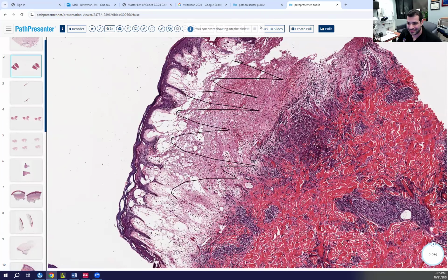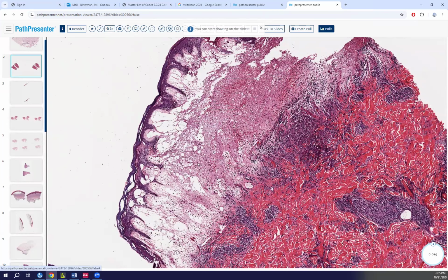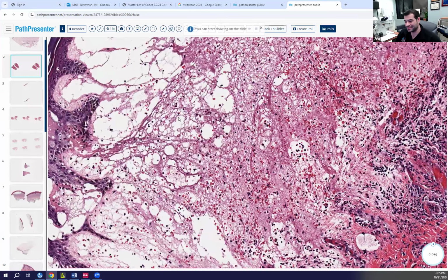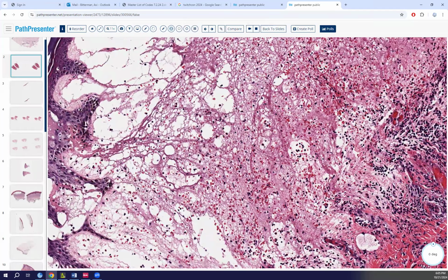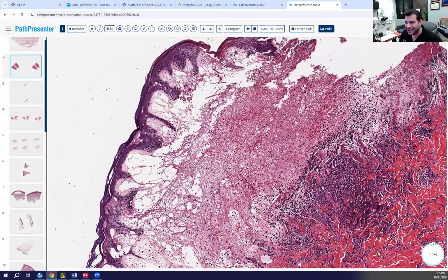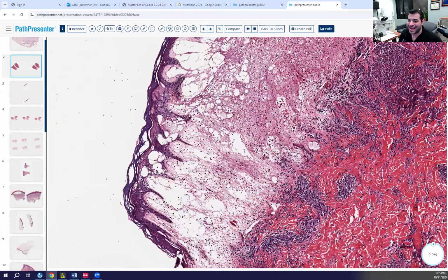Blood. I see red blood cells. Yeah, but not the cells. Fibrin? Yeah, there are these gossamer strands. So when you get a massive edema like this, the pressure just pulls the epidermis off of the dermis. And so that's a difference.